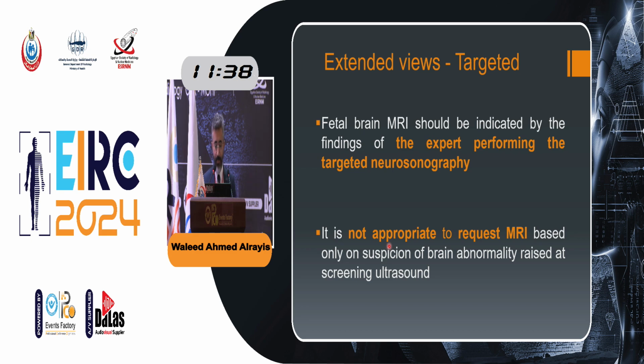Fetal MRI shall not be indicated except if we have some finding from the expert performing the fetal neurosonography. And it's not appropriate to request MRI based only on suspicion of brain abnormality raised at screening ultrasound.